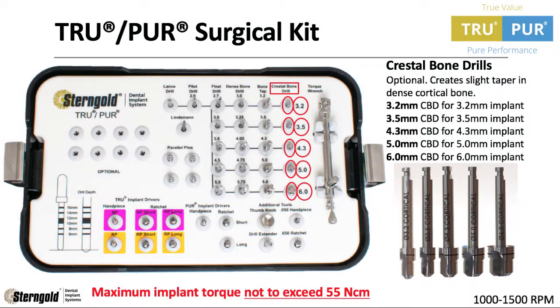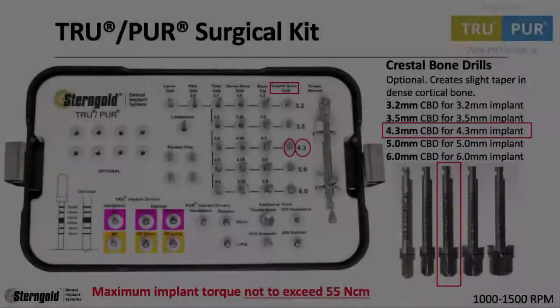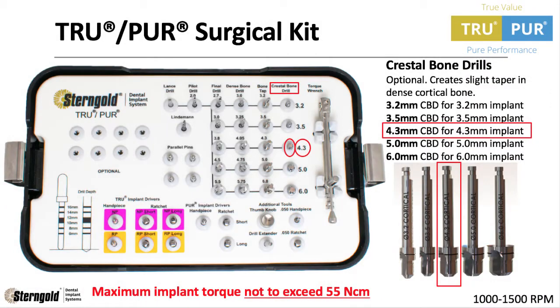The cortical bone drill is optional and creates a slight taper in dense cortical bone. This is designed and intended to prevent exceeding the maximum torque of 55 newton centimeters when placing Stern Gold's True and Pure dental implants. We're placing the True 4.3mm implant, so let's use the 4.3mm cortical bone drill.